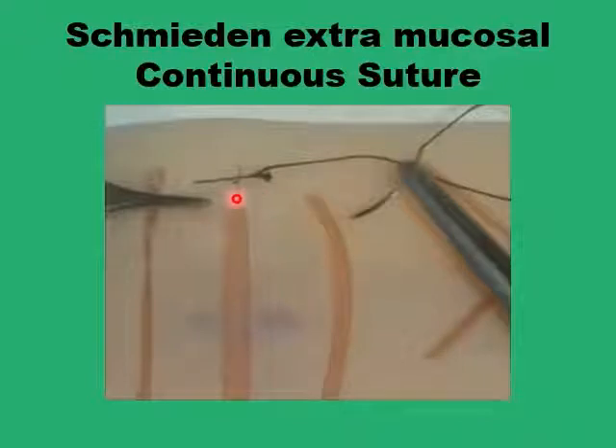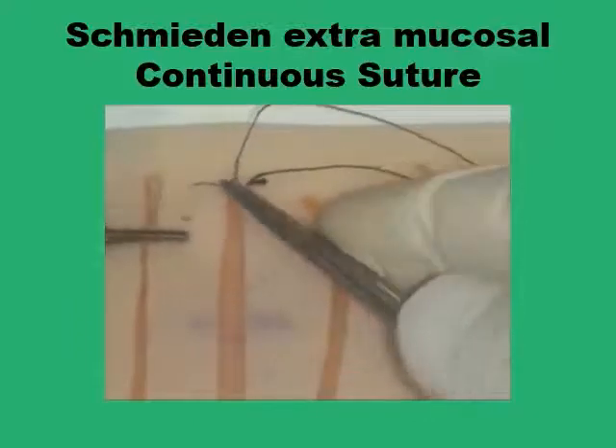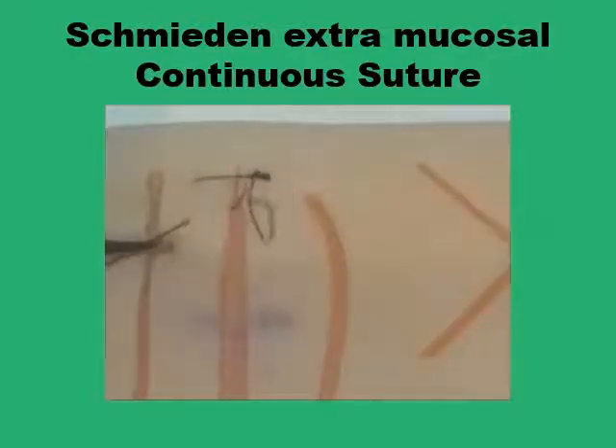You will take your bite at the edge of the wound avoiding the mucosal layer, just in the layer above the mucosa, and come out at the serosa, then repeat on the other side. The other thing is that you will be moving from one level to the next diagonally across the wound rather than parallel or perpendicular to the wound itself. We are starting now on the second level after the anchoring stitch, going through the edge of the wound sparing the mucosa.